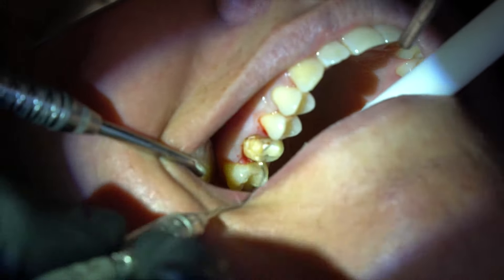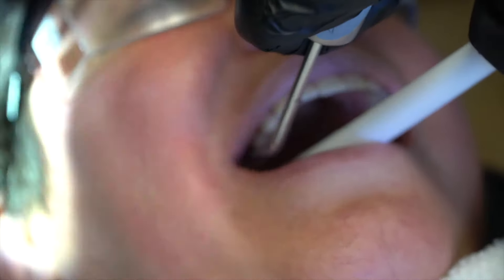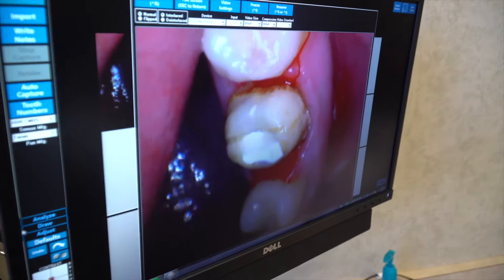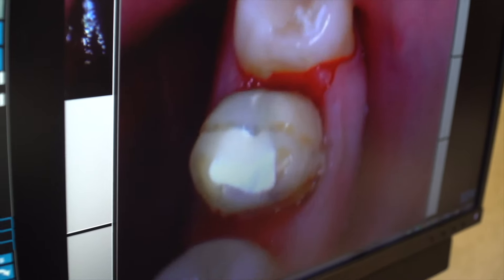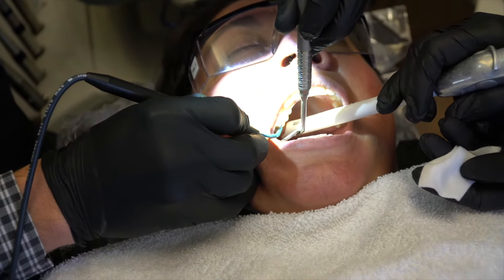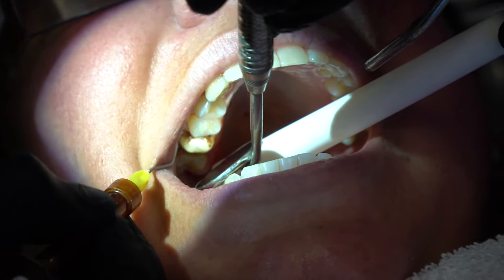You can see some staining there — the bacteria has gotten underneath. The gums are not happy. There's some decay on the back side of the tooth where the opening was, so we've got to clean that up. The gums are inflamed. We're cleaning up the inflamed gum tissue and getting access to the furthest extent of the tooth.